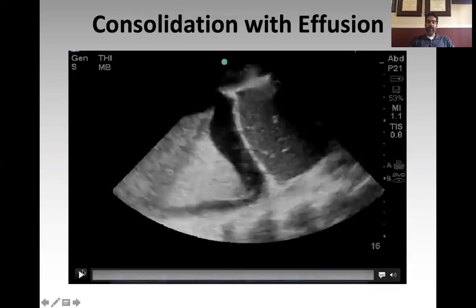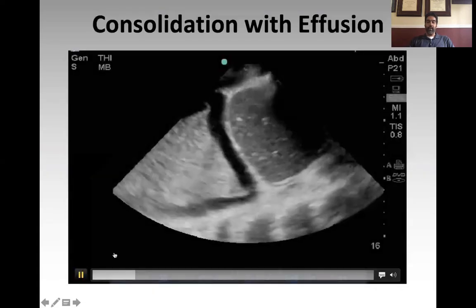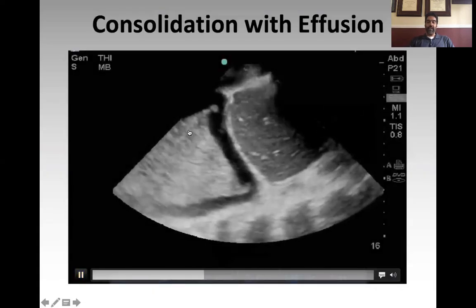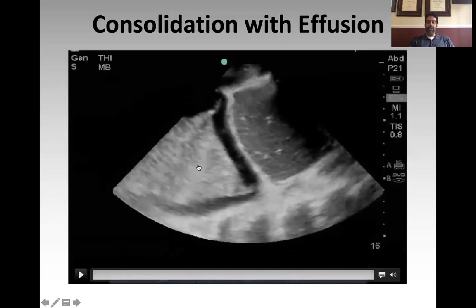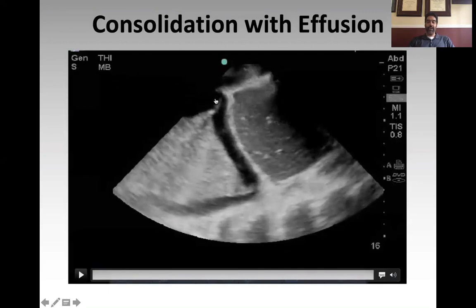Here's another example of consolidated lung. You can see this lung is de-aerated — you're directly seeing the lung tissue. There's some speckling from sonographic air bronchograms as well, and a small pleural effusion is also visible, along with the diaphragm and liver in view.